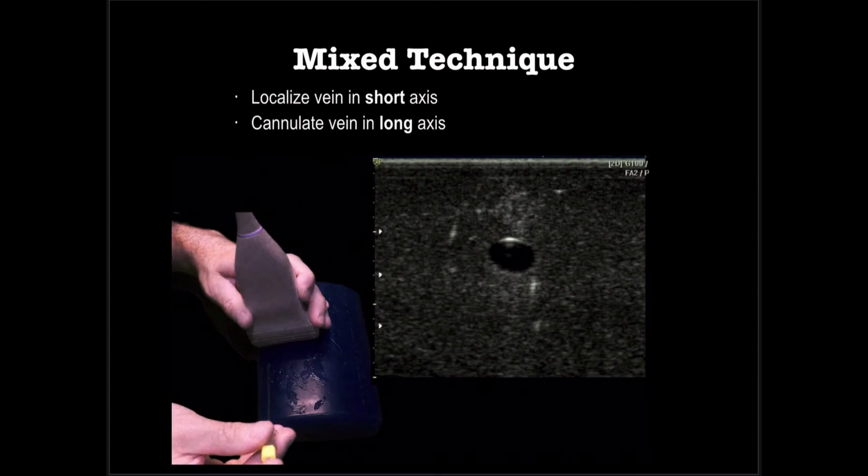So I hope that made some sense. It's really hard to do this without seeing you guys and knowing you're getting what I'm saying, but when you practice this, and y'all can practice today or whenever your residency director says you have some time, you can practice this on the ultrasound transducer and phantom we gave you. It'll make a lot more sense.